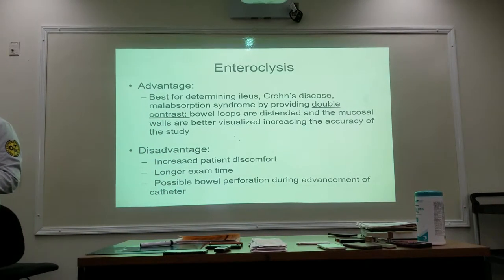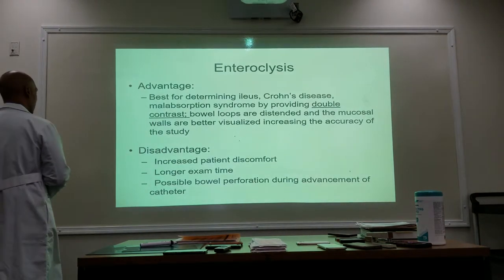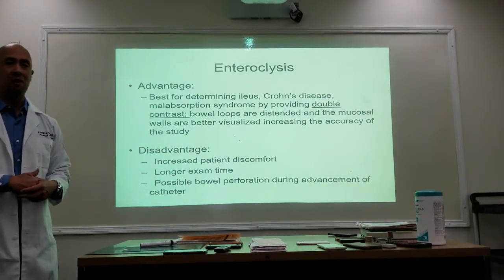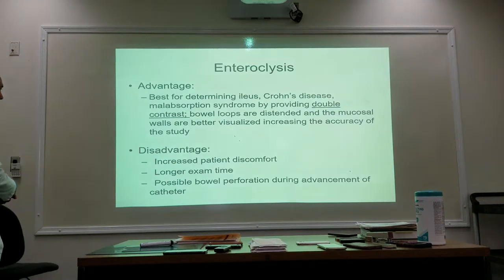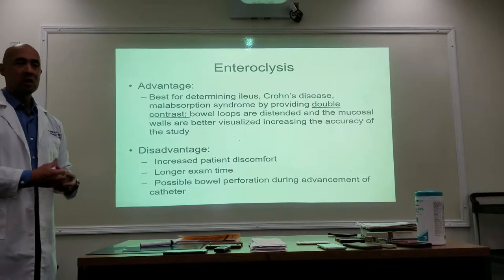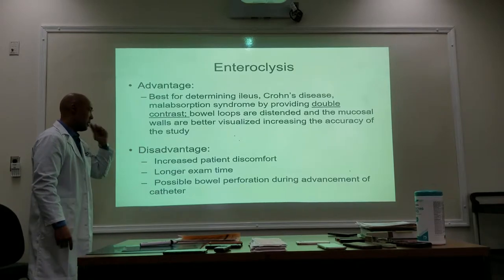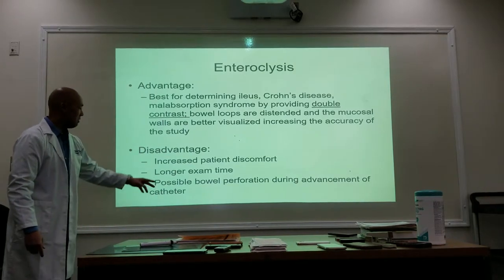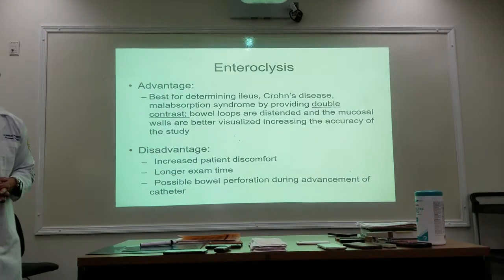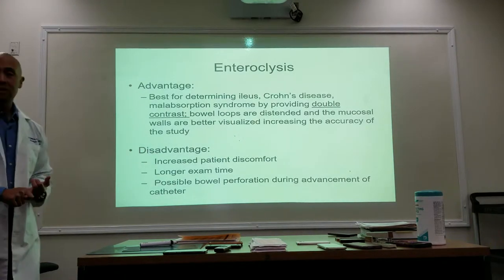The bowel loops are distended and the mucosal walls are better visualized for a more accurate study. The disadvantage here is increased discomfort, because you're pumping air into the small bowel. It hurts. The small bowel is not designed to be distended like a large bowel is. It's also longer to do, and because you're pumping air in there, there's possible perforation, not only by the catheter, but also from the amount of air you are pushing through that catheter. So now you have distension as well as catheter types of perforations.